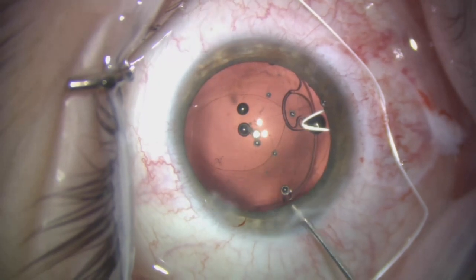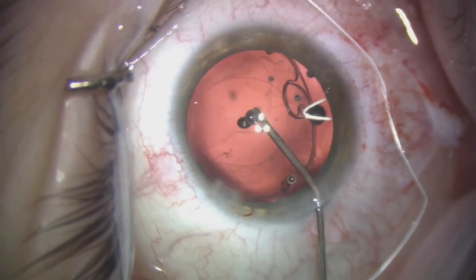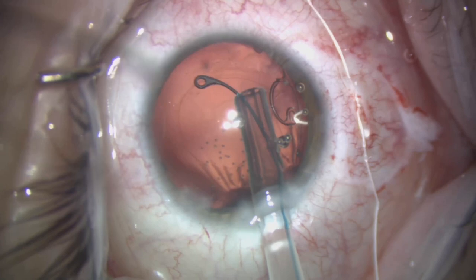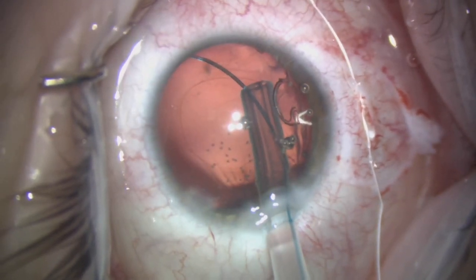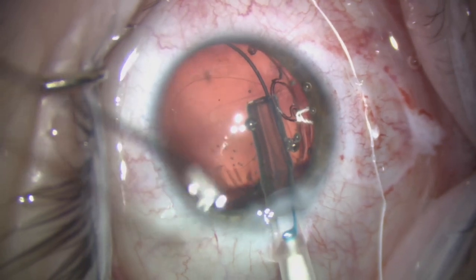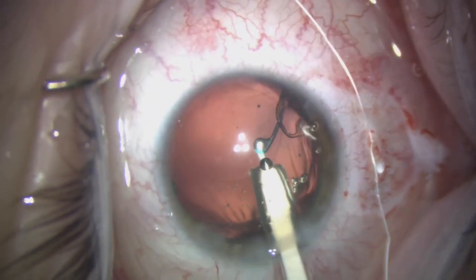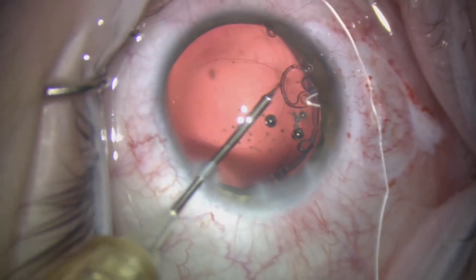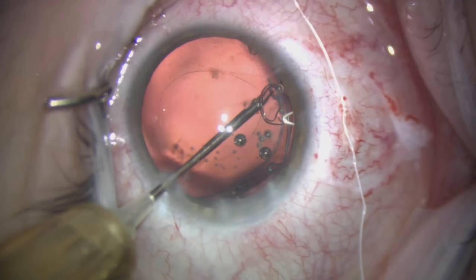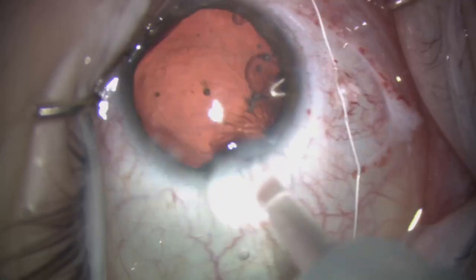We once again fill the bag with some cohesive viscoelastic — normal Helon Pro — then ratchet up the tension a little more. We now place a capsular tension ring to augment the degree of support to the capsular bag. As the capsular tension ring comes around, in this case it catches slightly on the edge of the segment, so we use a micro grasper to release it. You can use micro graspers relatively easily to readjust the position of the ring.